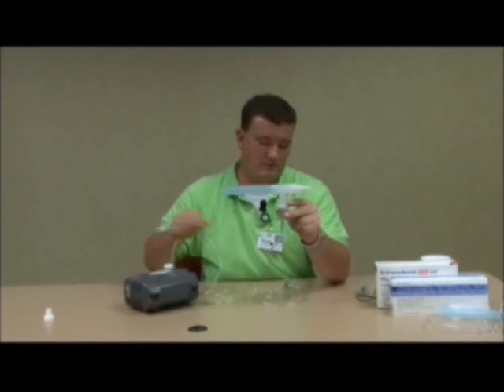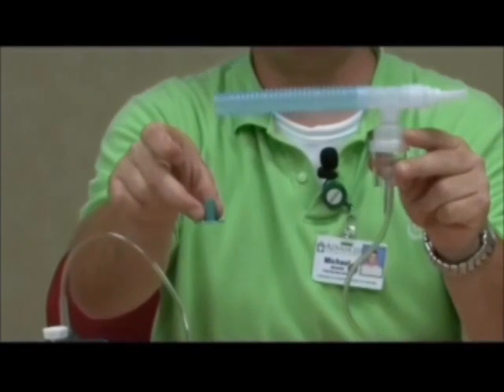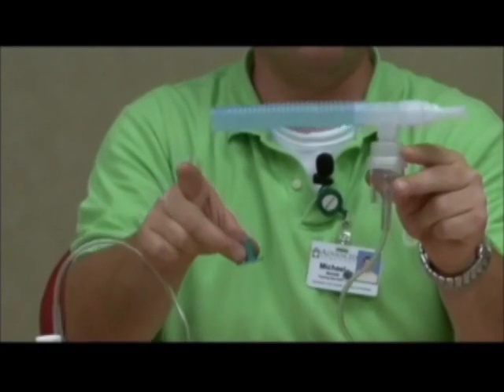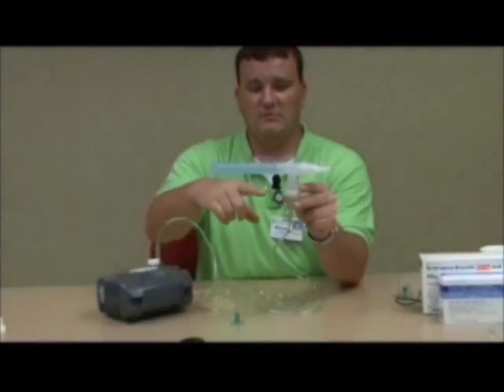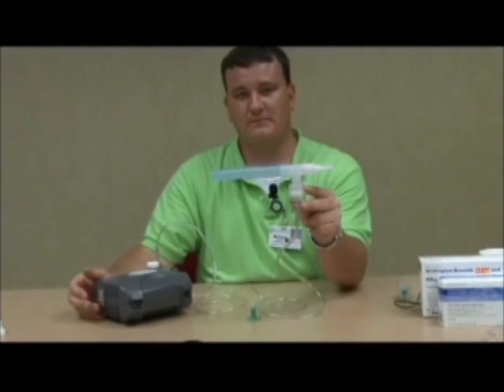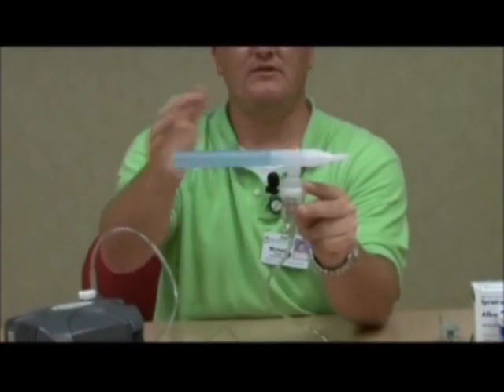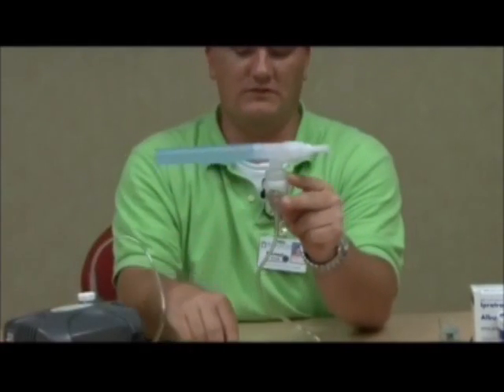I want to show you what it looks like if your treatment is not doing what it's supposed to. A typical problem is the patient or caregiver leaves out this very important part, which is called the baffle. Without this piece, the micro-mist kit is not able to produce mist like it's supposed to. For demonstration purposes, I'm going to turn this on so you can see — the medication is in the cup, but the baffle is missing. As you can see, there's not the mist that you had when the baffle was there. This is a very important piece.